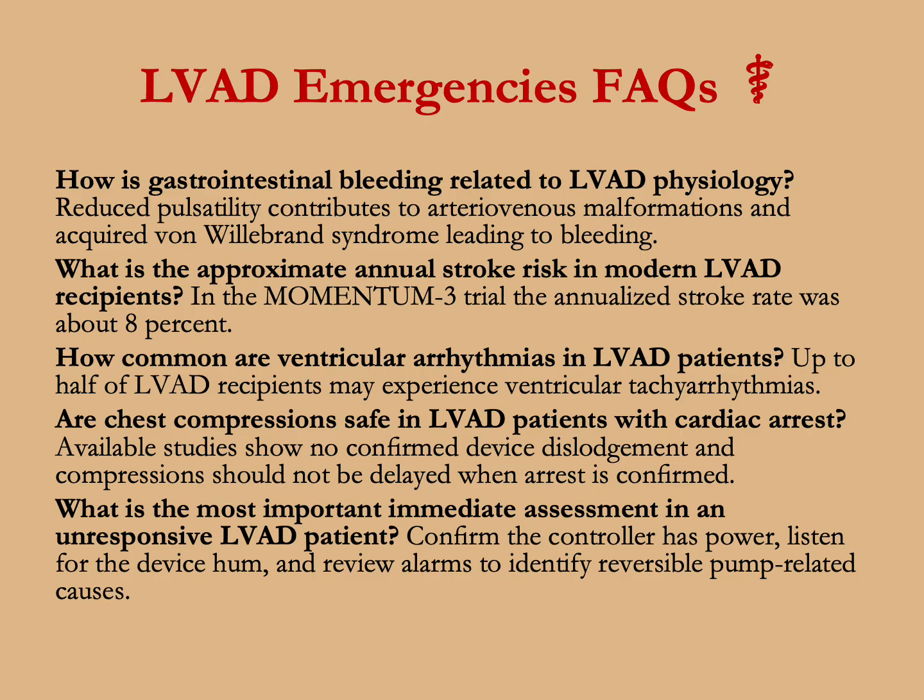What is the most important immediate assessment in an unresponsive LVAD patient? Confirm the controller has power, listen to the device hum, and review alarms to identify reversible pump-related causes. This is in a nutshell from the JACC State-of-the-Art review. Read this fantastic review for more details and a comprehensive overview on this very important topic.